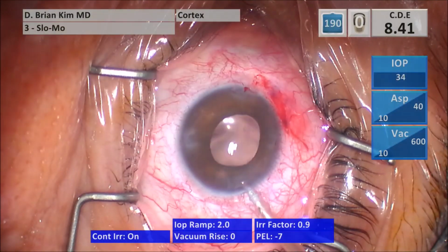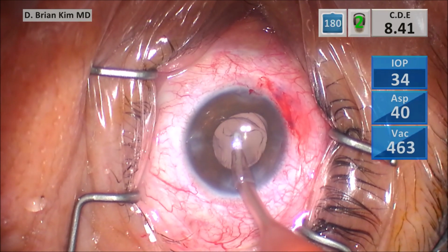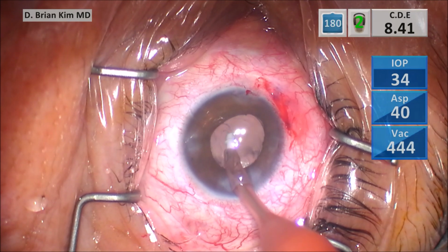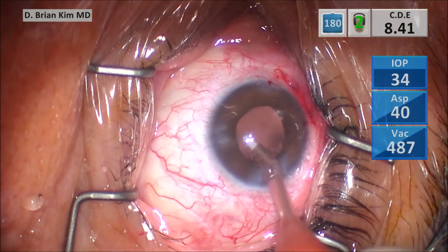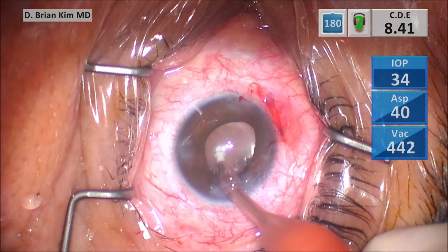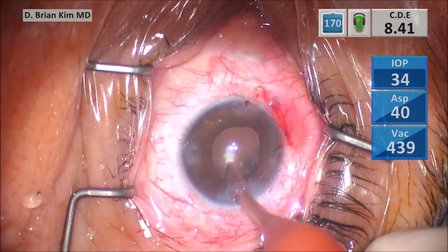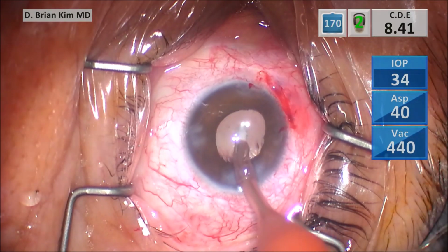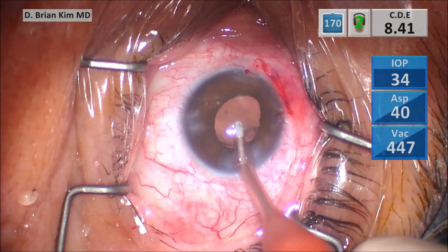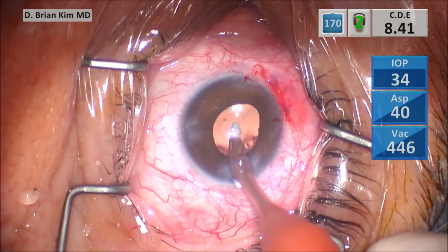So I go in with the I/A handpiece and remove all the dispersive viscoelastic from the anterior chamber. Mind you, I did not encounter any vitreous throughout the case. The lens was nice and stable within the capsular bag. I did place a CTR because there was an area of zonular dehiscence. I used my capsular tension ring injector technique using the Lester hook to compress the CTR to minimize any torsional stress on the zonules. And again, I was able to perform an iridodialysis repair using a sewing machine technique.